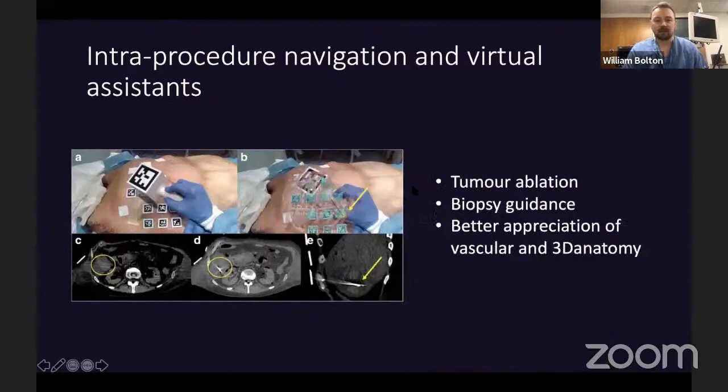This is just an augmented reality, interventional radiology example that I managed to Google, essentially, to be honest with you. I thought it was quite cool. They've got QR code registration stickers, markers on here, over some bony landmarks, I assume, or some ribs, so that you can reference to the actual images. And then you've got a handheld device so you can plan your procedure.